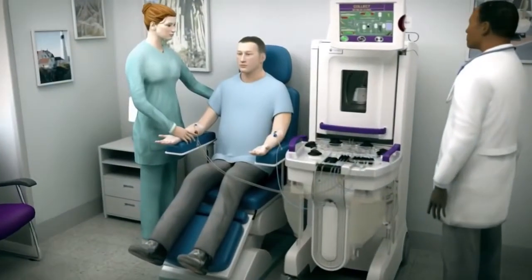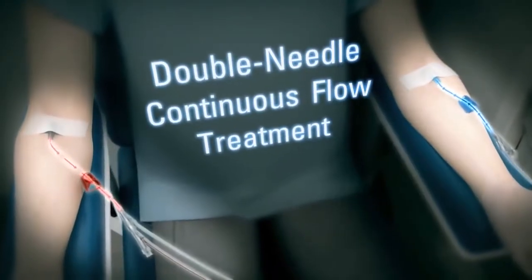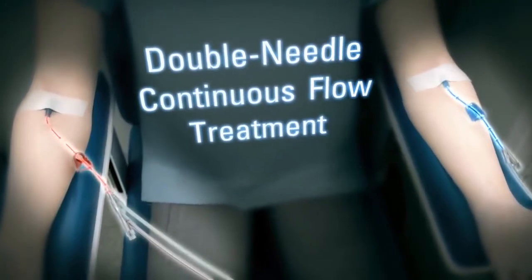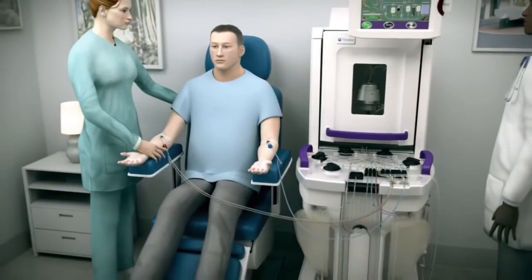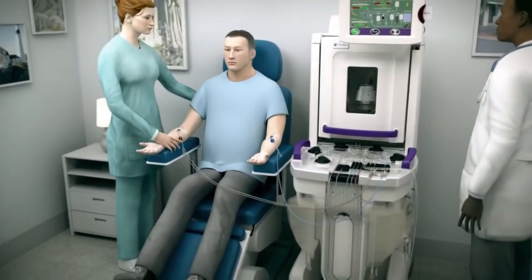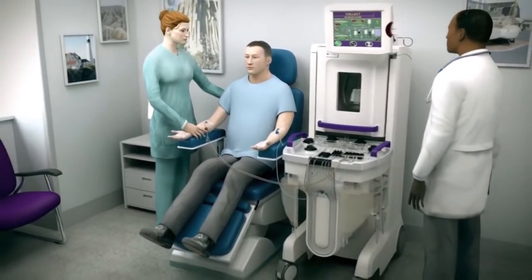With the Celex system, physicians are now able to perform a double needle continuous flow treatment for patients, with the option to easily change to single needle mode if one access fails during treatment. The continuous flow technique minimizes extracorporeal volume and reduces the overall procedure time as compared to the UVAR XTS photophoresis instrument.